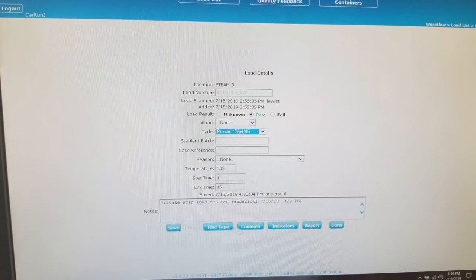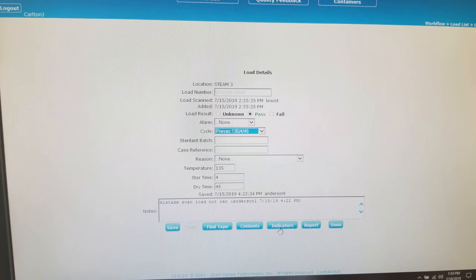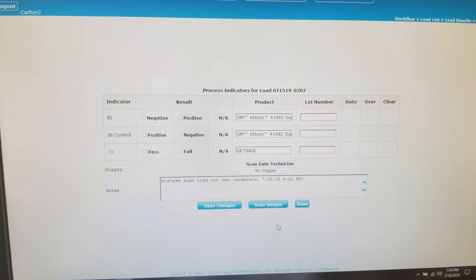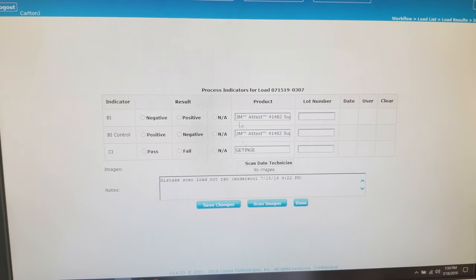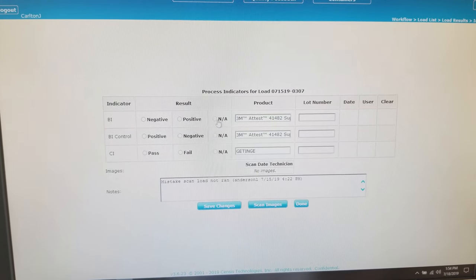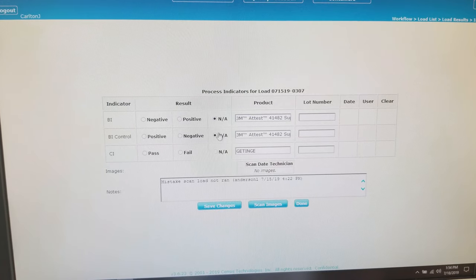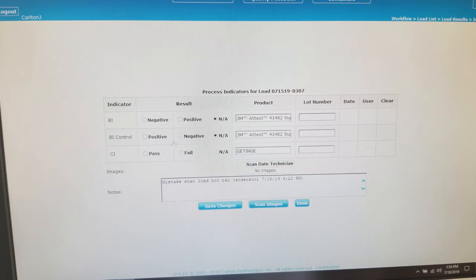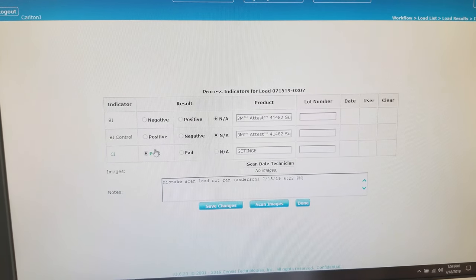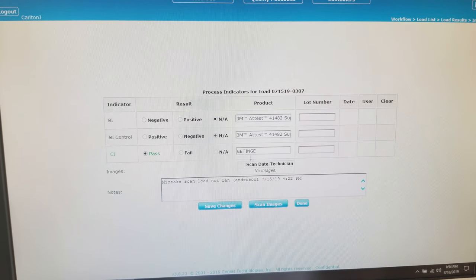Then we want to go to the comments section and type in our cycle count number. Next, we want to save all that we've done on this page.